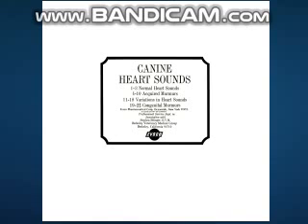Murmurs and variations of the heart sounds may indicate the pathologic condition affecting the heart. A description of the sound is beneficial when making a diagnosis. First, note whether the abnormal sound is present during systole, diastole, or both. Then, determine how long the abnormal sound persists during that phase of the cardiac cycle.